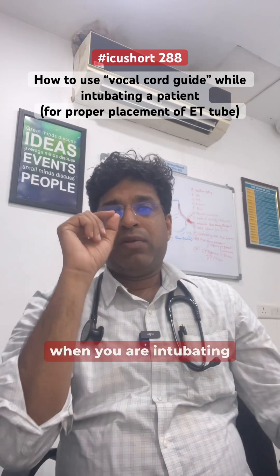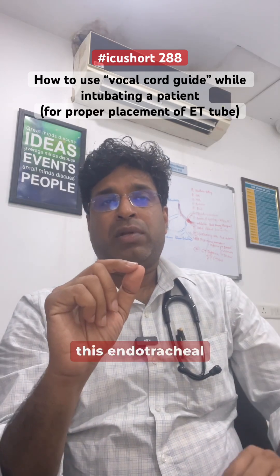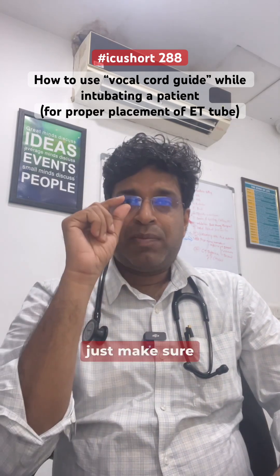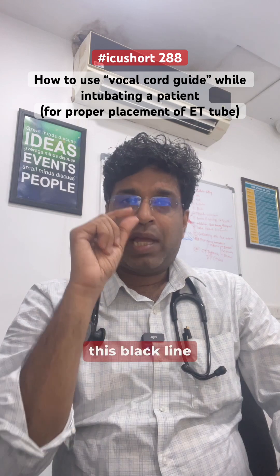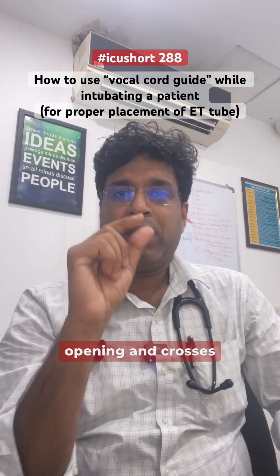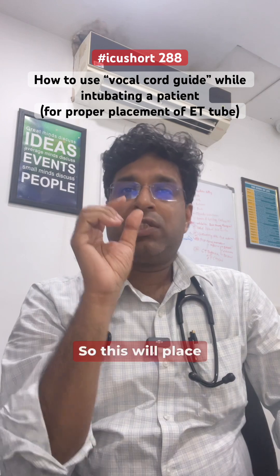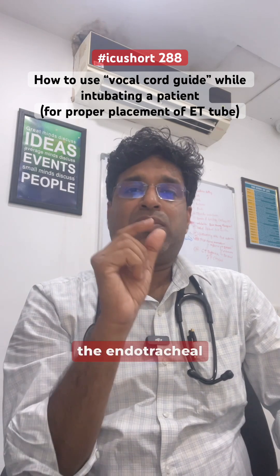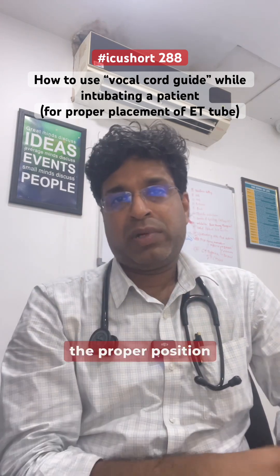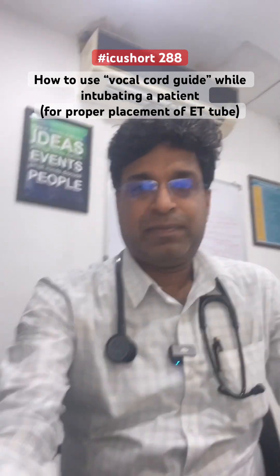When you are intubating, just make sure this black line crosses the tracheal opening and crosses the vocal cord. This will place the endotracheal tube mostly in the proper position. Do read more about it. Thank you.